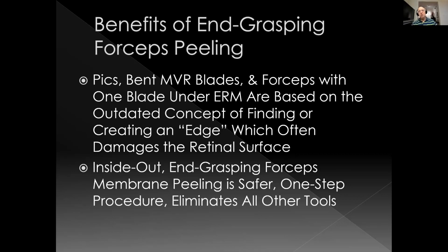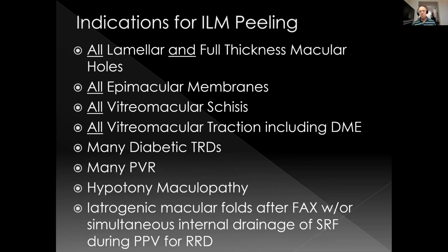I never ever use triamcinolone to mark the epiretinal membranes. It is a mistake in my view. It is no more specific to the ILM than it is to seeing if there's dust on your countertop at the hotel to see if the maid had dusted it off. So it is certainly useful to visualize vitreous, but now when you use Ingenuity, you see vitreous so well anyhow, I really find no need for triamcinolone particulate marking of vitreous, and I've never seen any need to use triamcinolone for the ILM.